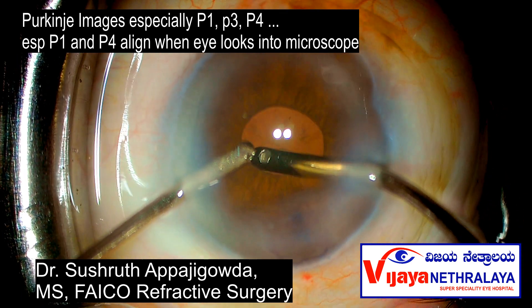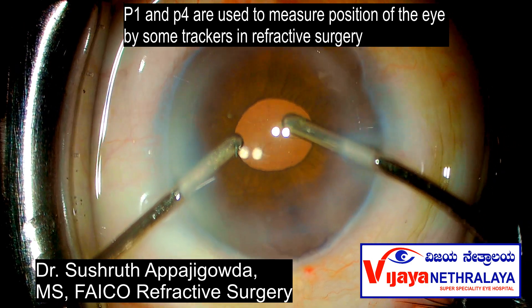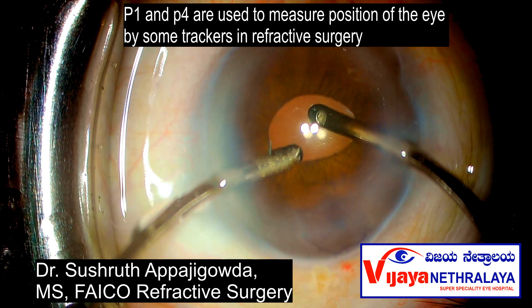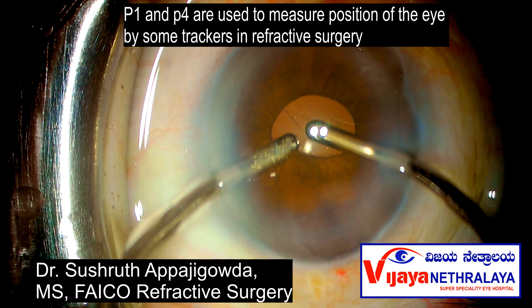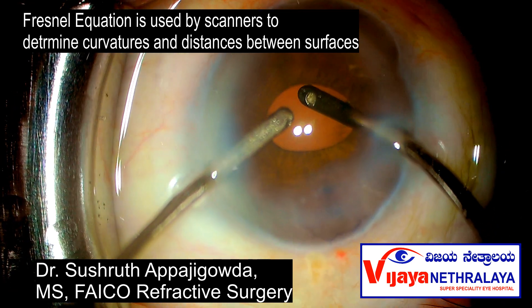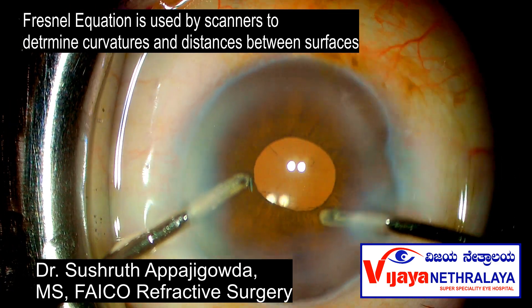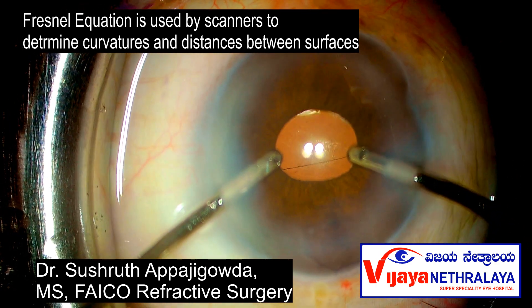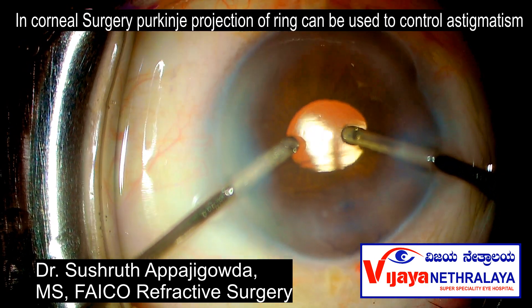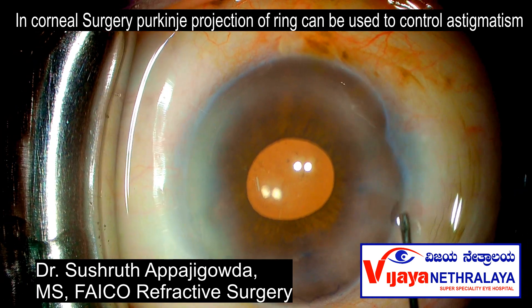Applications of Purkinje images include: the first and fourth Purkinje images are used to measure the position of the eye by some trackers in refractive surgery. By using Fresnel's equation, Purkinje images are used by some scanners to assess the curvature and separation of the surfaces in the eye. In corneal surgery, a Purkinje projection of a ring can be used to control astigmatism.